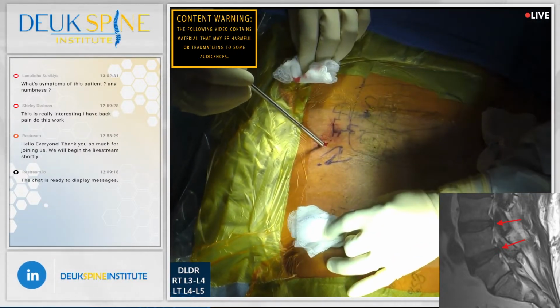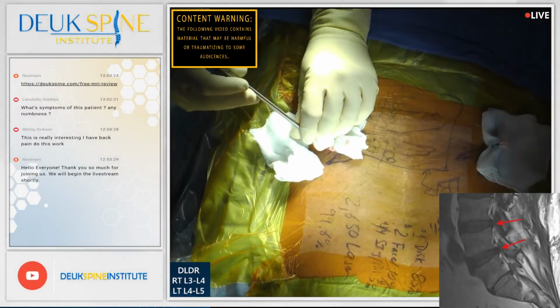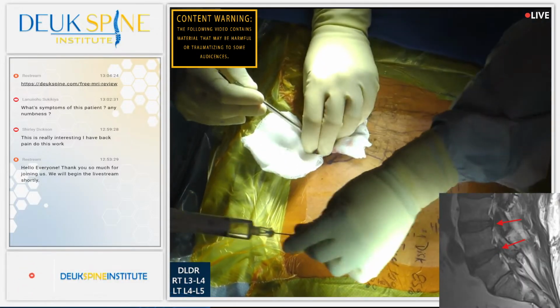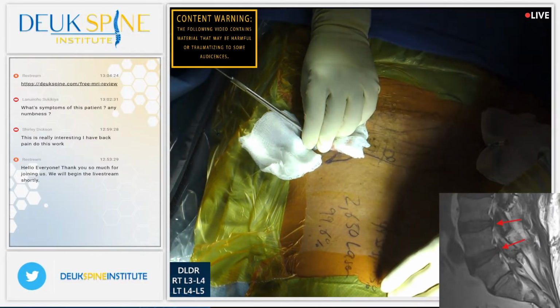We just made a 1/4-inch incision, and we're going to go in now with our dilator down the guide wire. It's a very safe surgery as long as it's done properly. We're going to give a little more numbing medicine to make it comfortable for the patient.